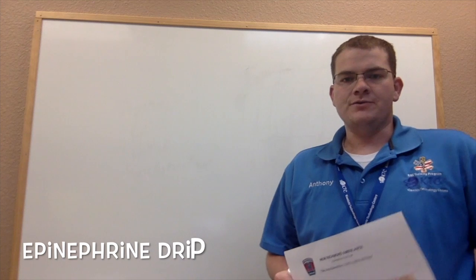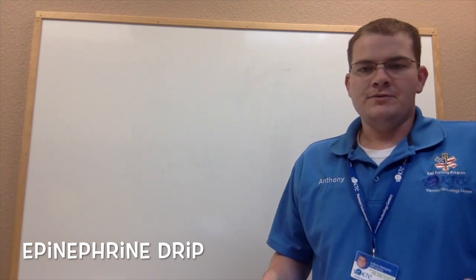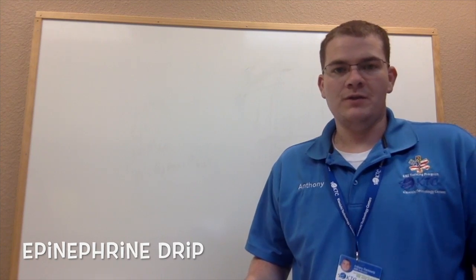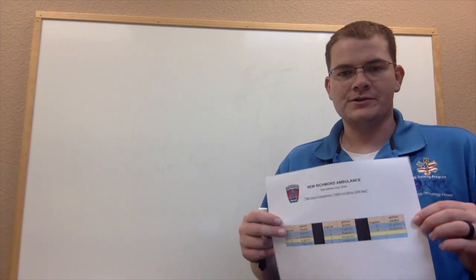Okay, let's mix this epi drip. Whenever we do epi drips, we don't get to do them a lot, so we need to make sure that we're practiced up on them, that we have a plan for how we're going to do them. That plan most of the time comes back for a lot of people to looking at a chart in your protocol book or on your phone or something.